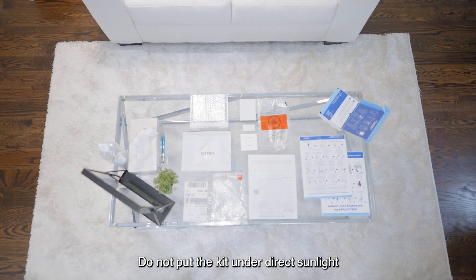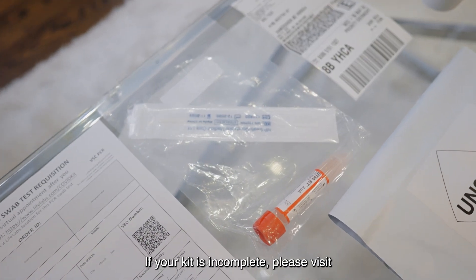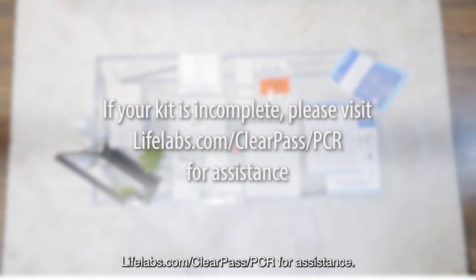Do not put the kit under direct sunlight or open the swab wrapper or tube cap until you are ready to test. If your kit is incomplete, please visit lifelabs.com/clearpass/pcr for assistance.